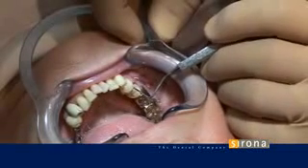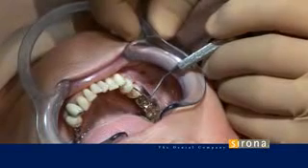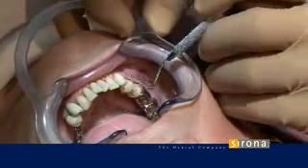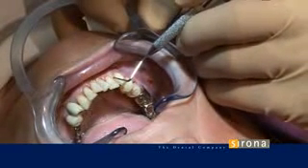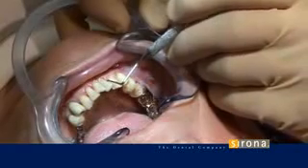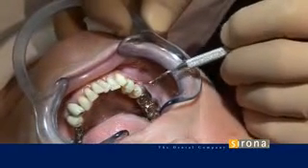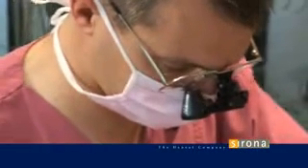For the interiors, it is a little less. Here the pocket depth is 5 mm, 3 mm, 3 mm, 3 mm, 4 mm. You can very well recognize the resulting bleeding that is caused by the inflammation around the tooth.